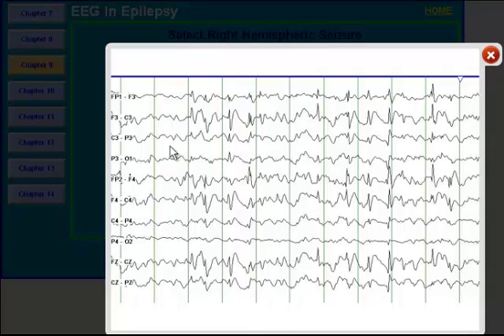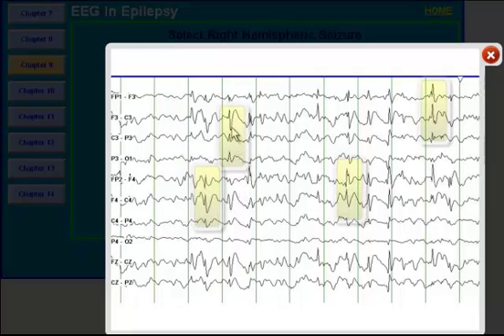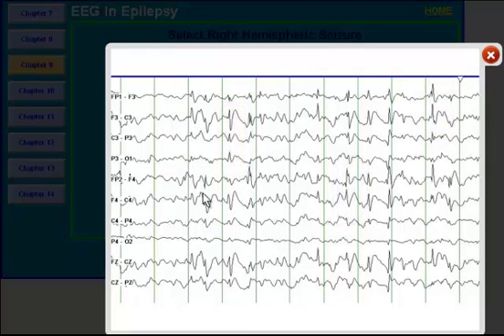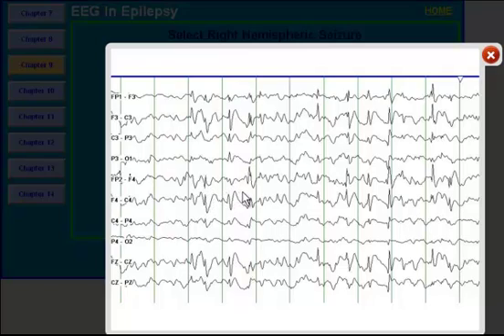Do you see a seizure on the left hemisphere or the right hemisphere? You see sharp waves in the left hemisphere and the right hemisphere. There is no evolution in frequency or amplitudes of these discharges. The epileptiform discharges tell you this person is at high risk of having ongoing seizures, but there is no evolving pattern here. So you will not regard this as a seizure.